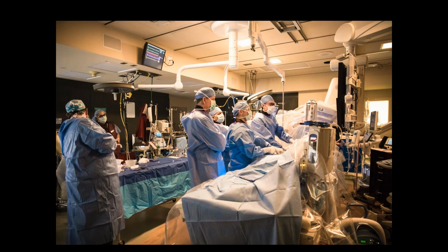The procedure is quick. We know the anatomy. We go in, and probably 30 to 45 minutes is how long it's taking us. Patient stays overnight in the hospital for 1 night, gets an ultrasound on the chest the next morning to make sure there's no pericardial effusion or anything. They go home the next morning with really no limitations.